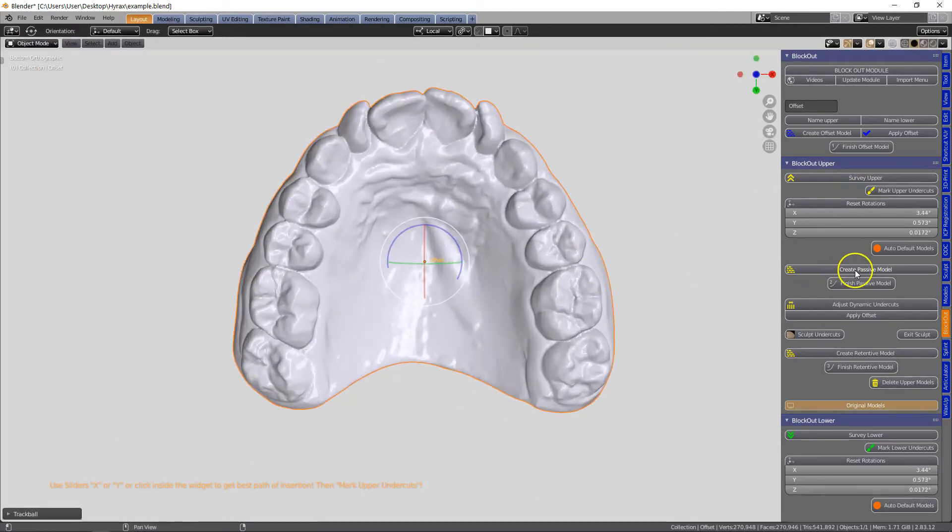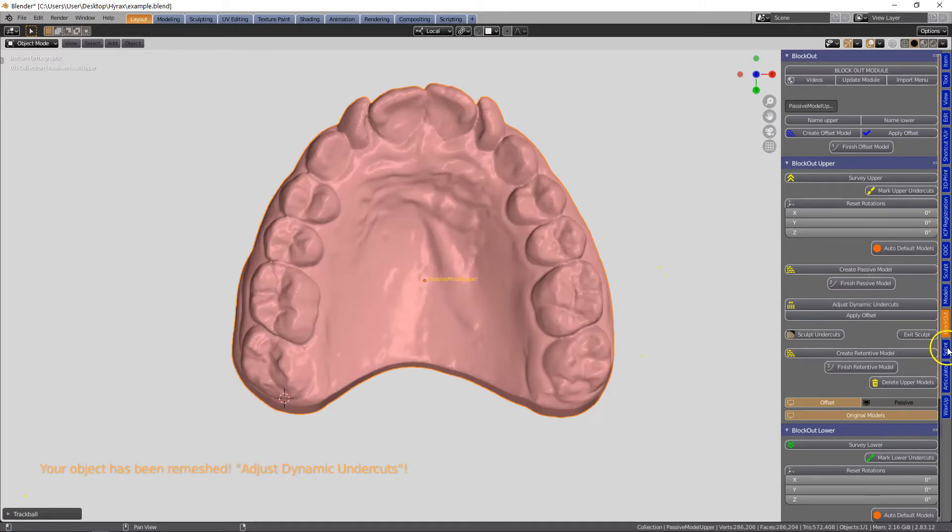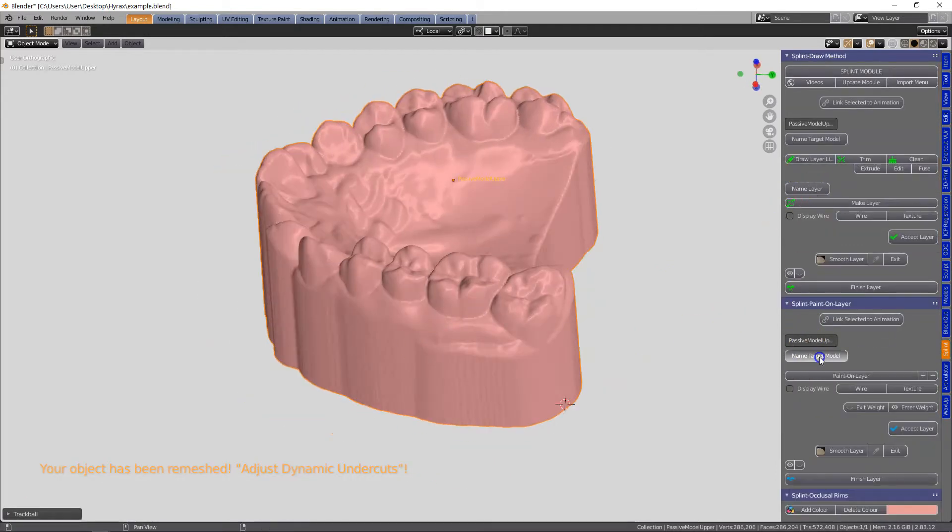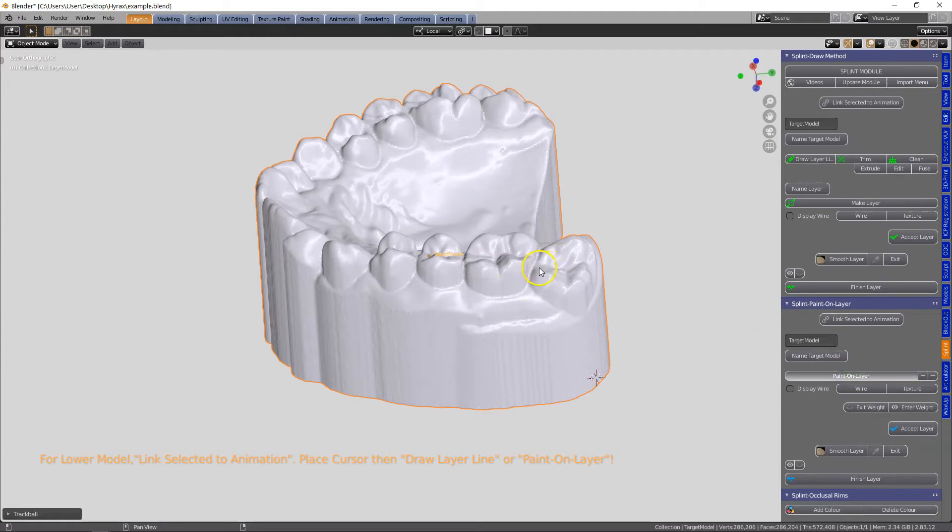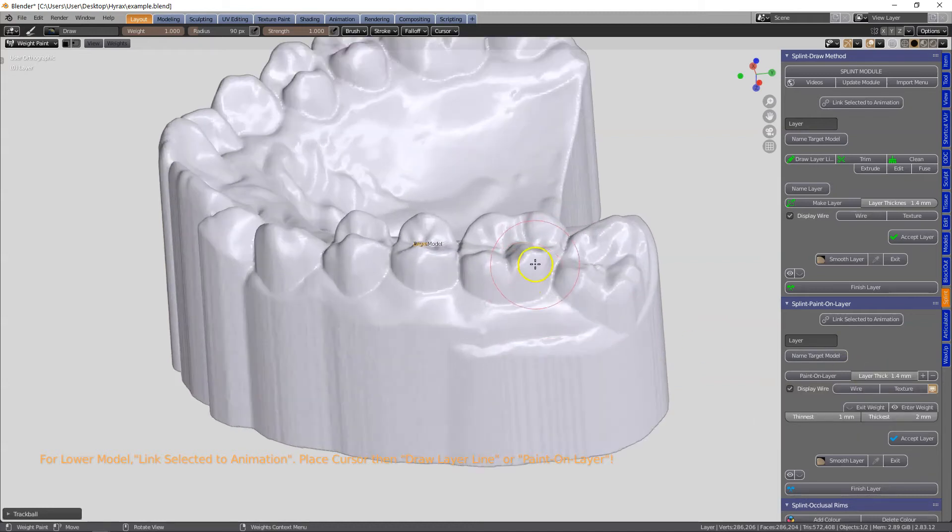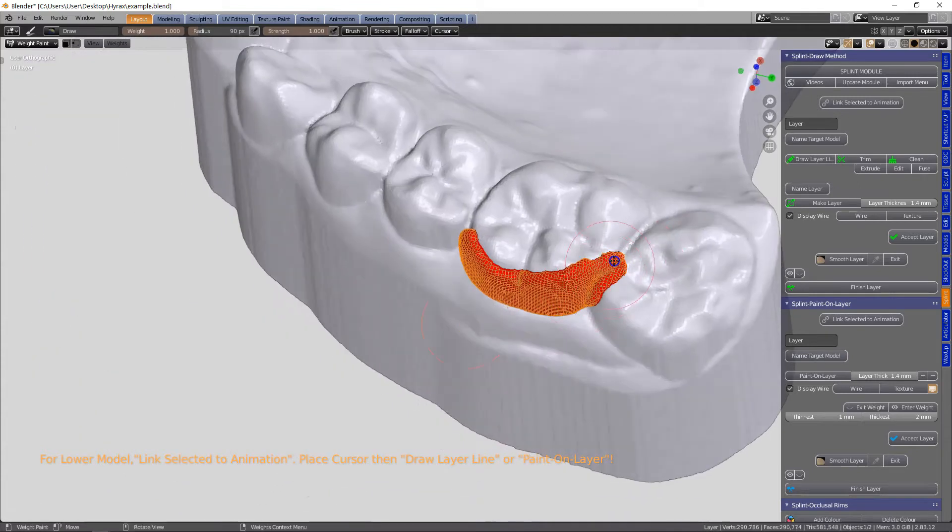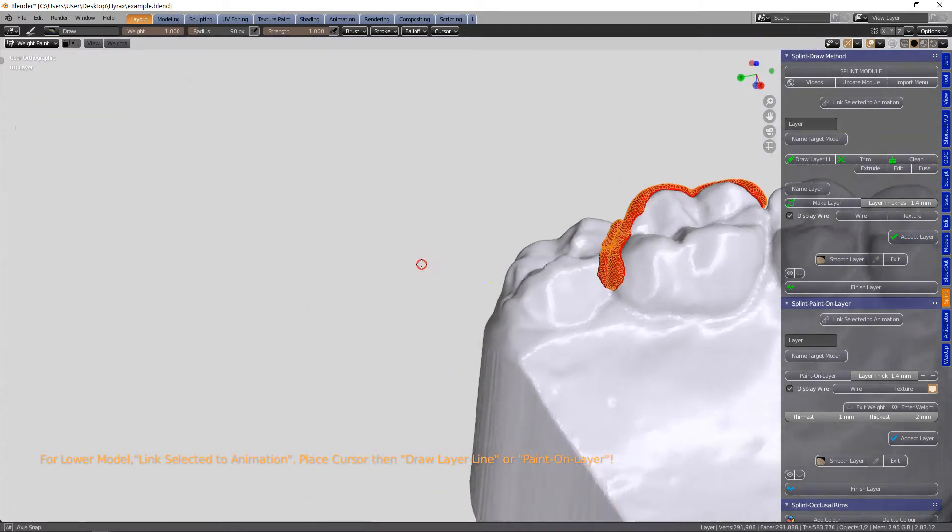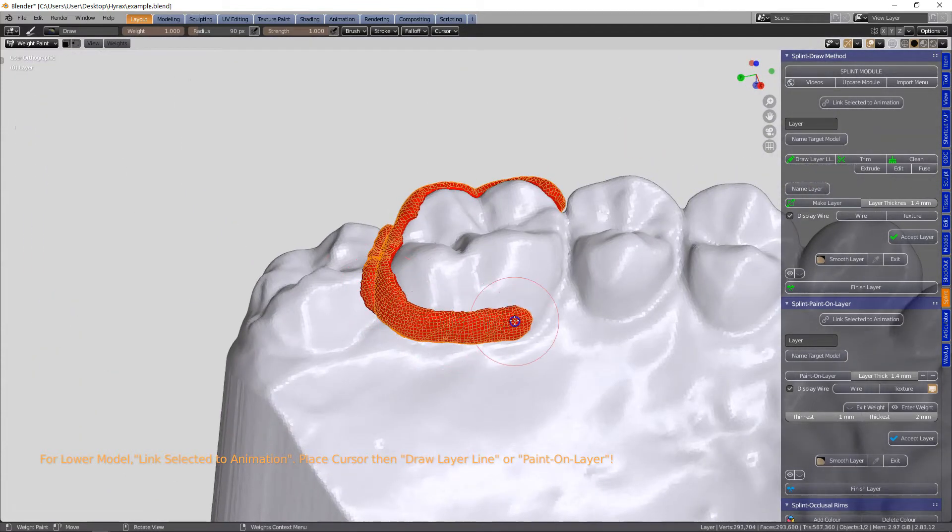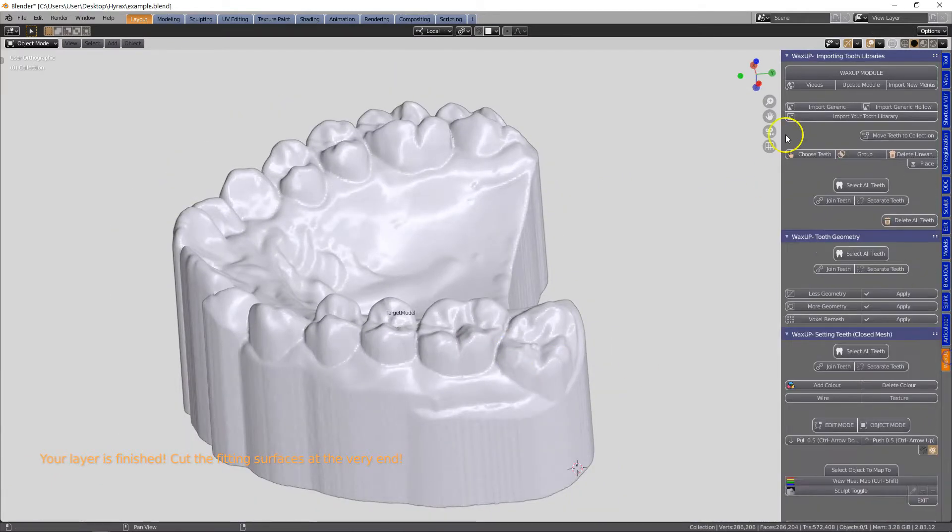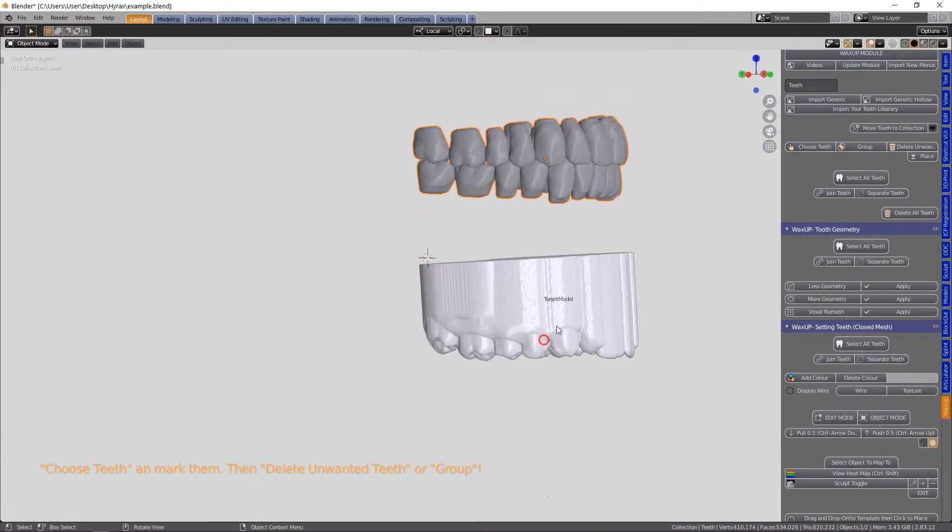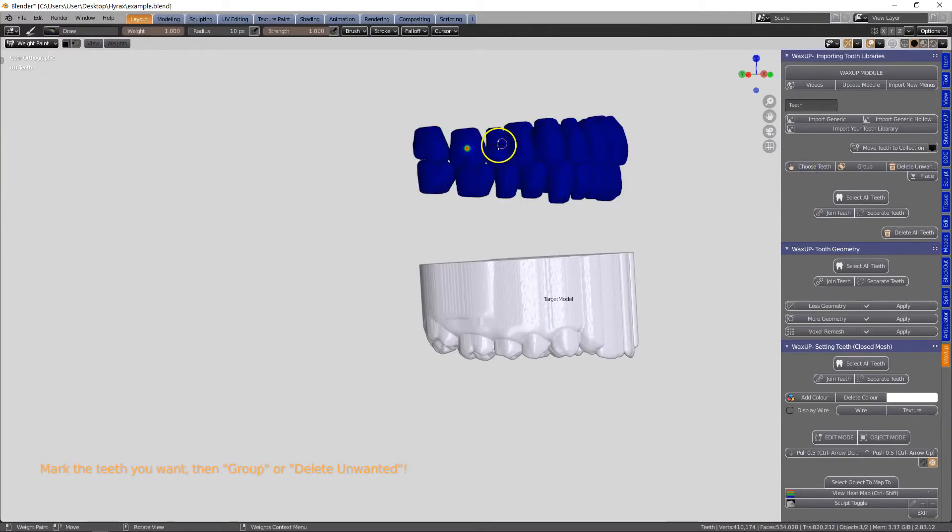We cannot have any undercuts - the model itself doesn't look like there are any undercuts anyway but let us pursue the option of an undercut free model. Then we go to the splint module and we're going to call a target model and we can paint on a layer. This is when we want to make orthodontic bands. I've set this to 1.4 millimeters which gives us a printing thickness of 0.7.